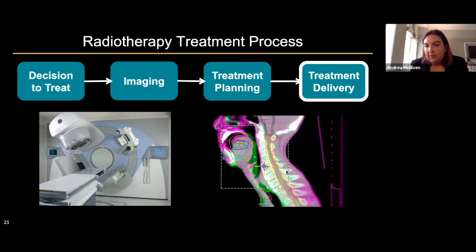Where we're white, we have the overlay and a good match between the images, but we have some discrepancies where you see more green or more purple, where there's some variation in the patient from the time they were imaged. And you can see on here, we have again certain contours: the GTV, CTV, and PTV, and also the spinal cord.